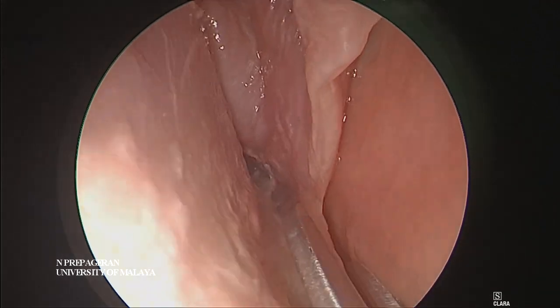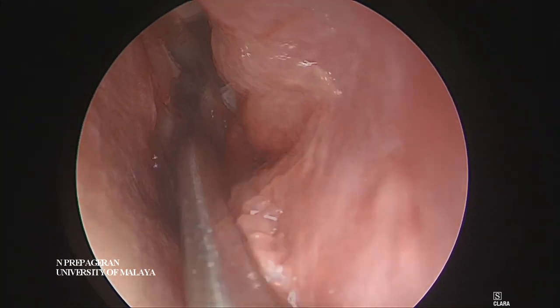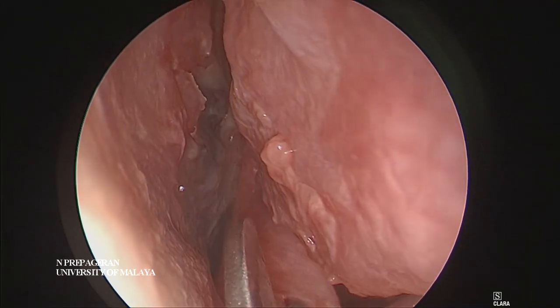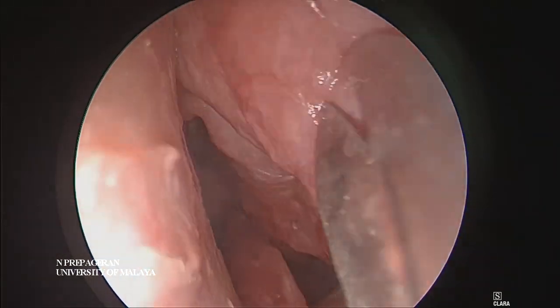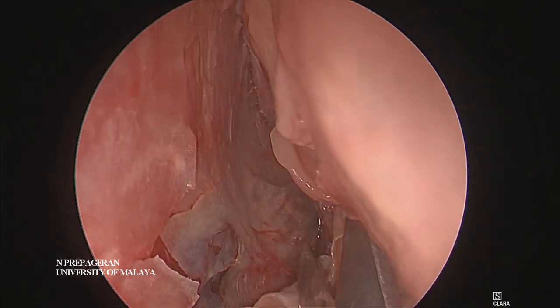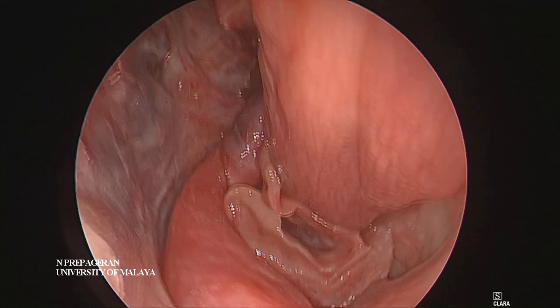Aim this slightly upwards so that you have a nice vertical flap. Now we have a vascularized septal flap. Make sure the pedicle is exactly beneath the ostia here. I'm going to cut this just beneath the ostia - can you see that? I've got a nice vascularized septal flap.